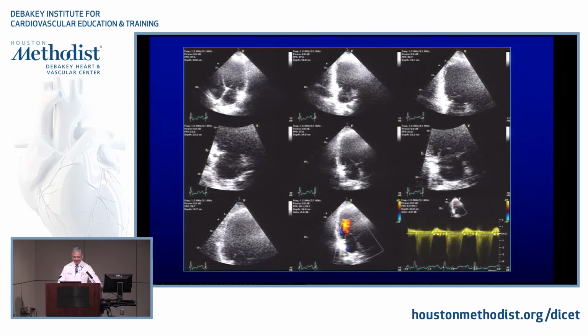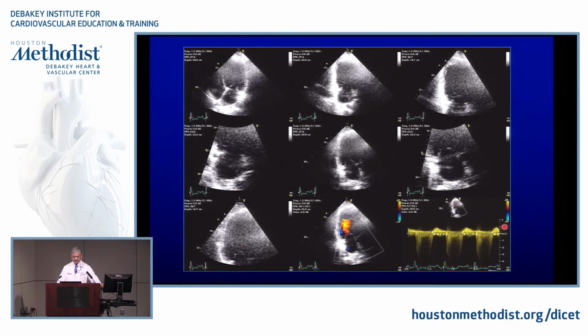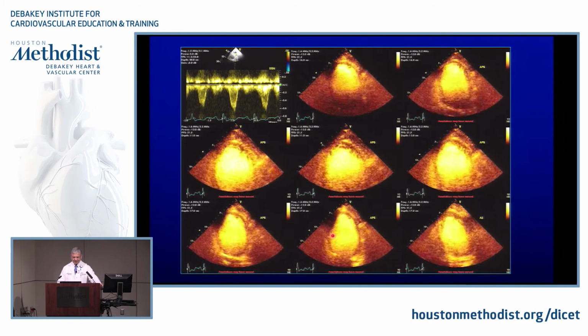All right, how about this one? This is reduced. So how do you read it? It looks big. Okay, it's a depressed, enlarged ventricle. Can you tell me something about regional function? There's some regional abnormality here. See this? Yes, some regional abnormalities here, but there are a lot I can't see, correct? Okay. That's the same patient. Would that change your management? Yeah. Okay, sounds good.